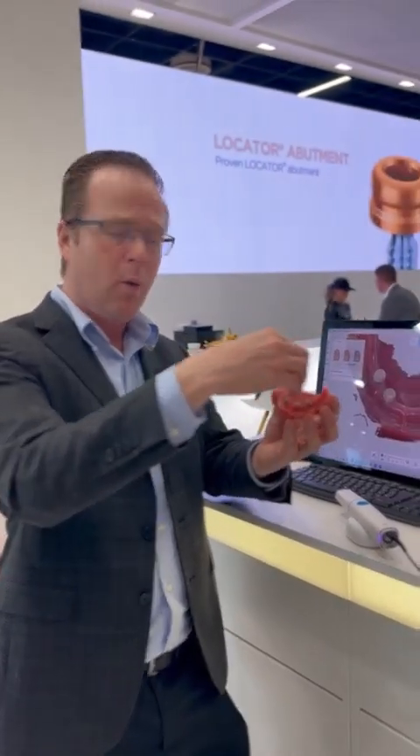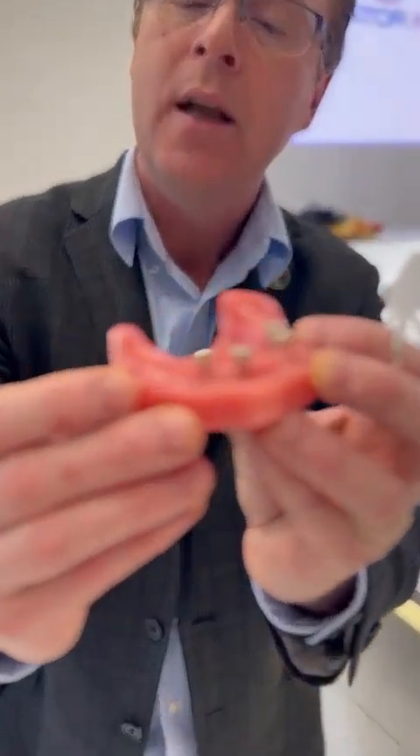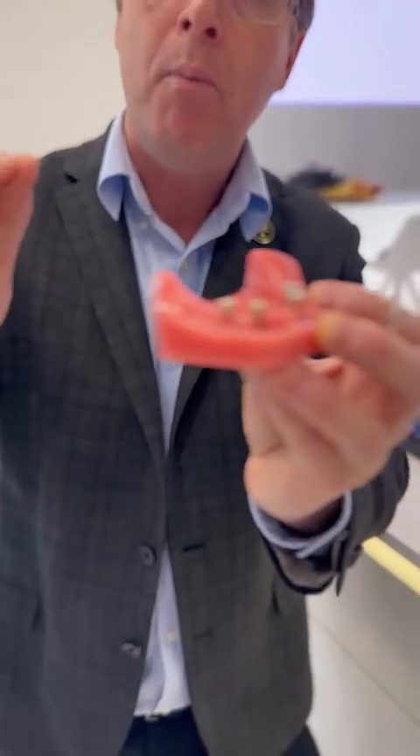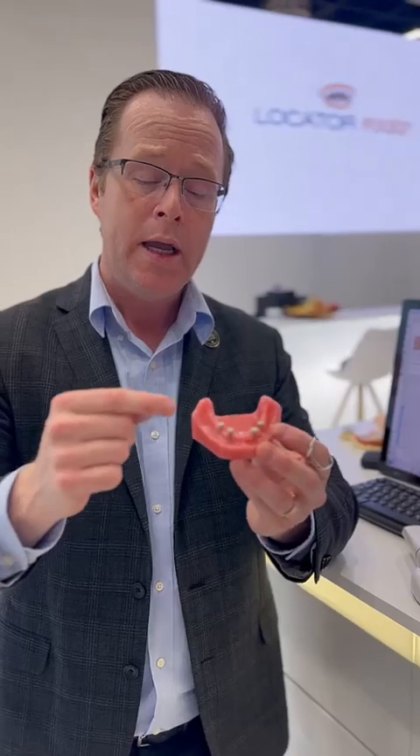Imagine I can just do a direct 3D print of that scan, have my laboratory do a wax rim over the top. Very easy, and then it's straight acrylic processing at the end to the shape of these scan bodies, which has the perfect geometry that's just 0.5 millimeters wider than a locator housing. So it creates the perfect recess size — process the denture over the top, then I do a chairside pickup of it and I'm done.